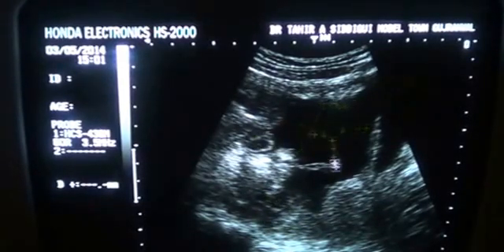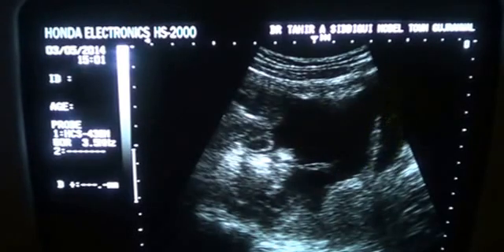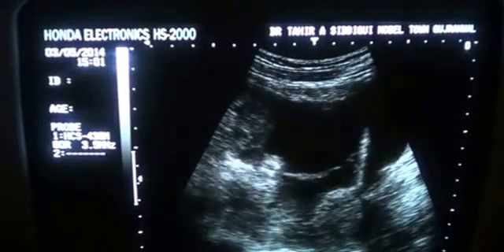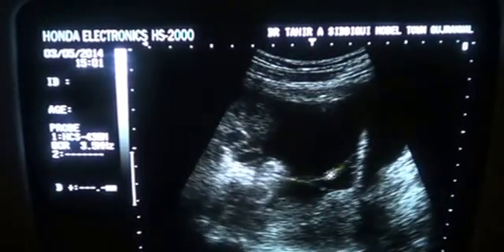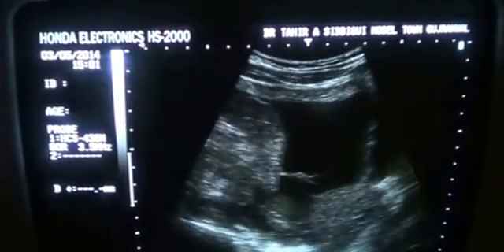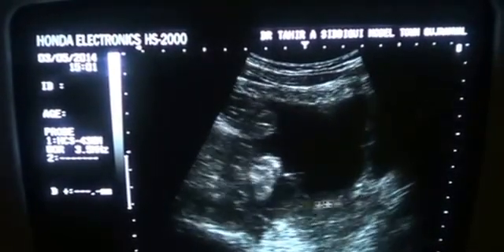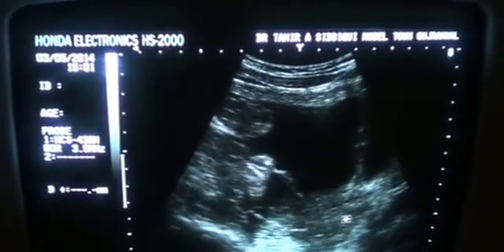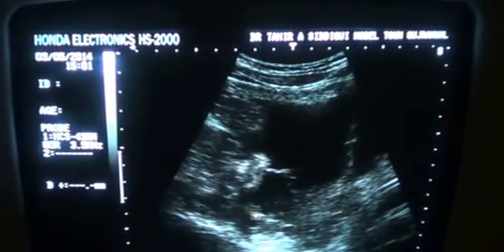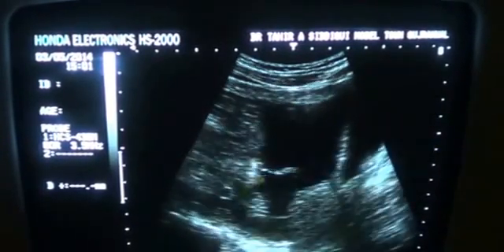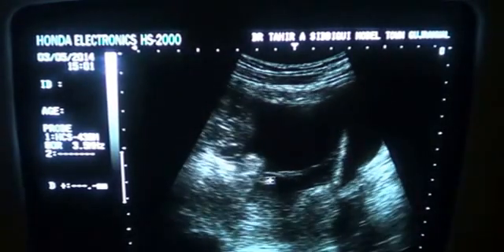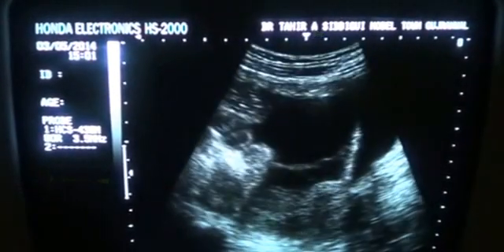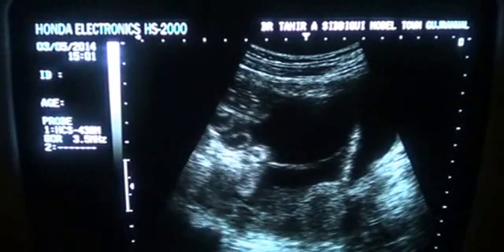These are the bowel segments in the ascitic fluid. In the coronal section, you can see the septa and the dependent region debris seen within it. In the debris you will see incomplete thin septa — this is an incomplete thin septal. This is rather a complete septal. You can see it's a complete thin septal floating, flapping within the ascitic fluid.